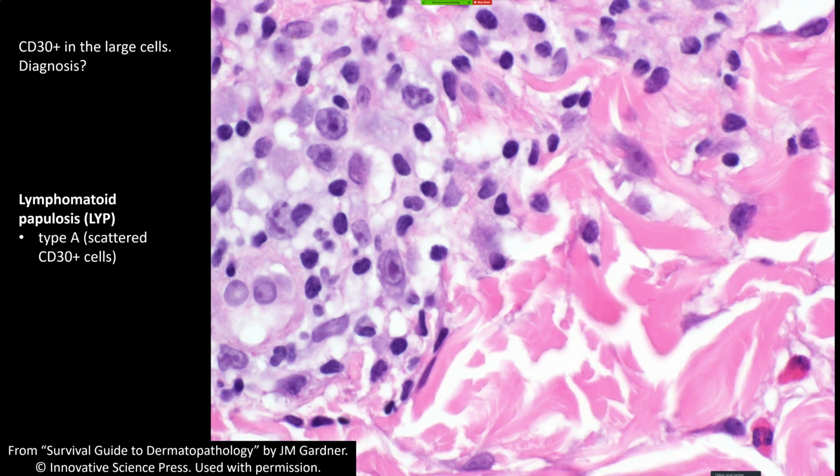The thing is that immunoblasts, which is the fancy word for reactive lymphocytes, reactive B cells or T cells, usually stain positive for CD30. They're kind of activated T cells. And so this is what my Hemepath expert friends have told me. So a lot of inflammatory reactive processes have scattered large cells that are CD30 positive.